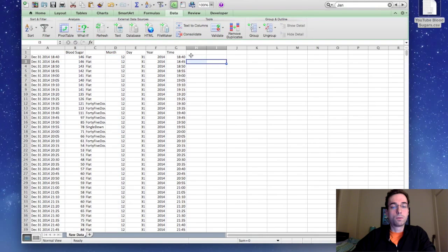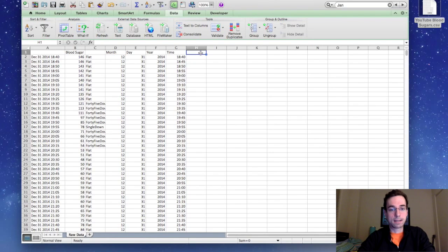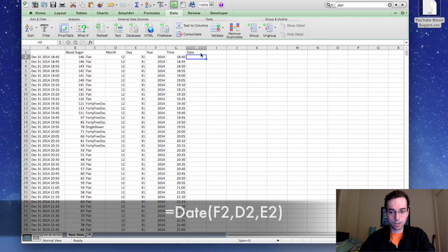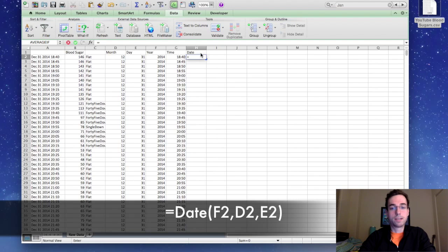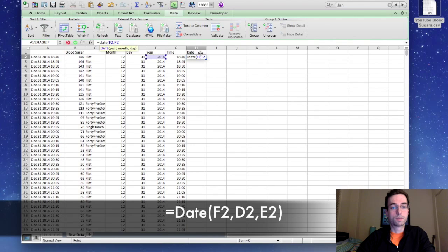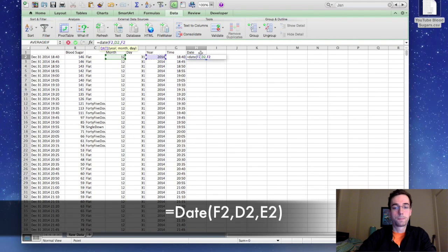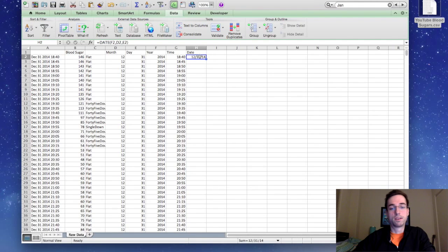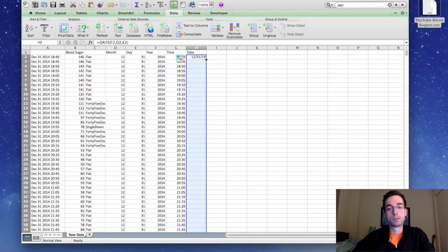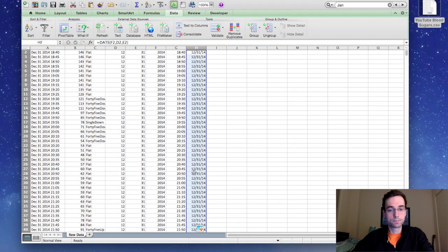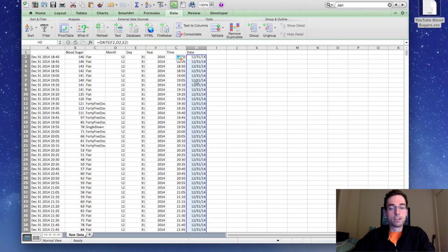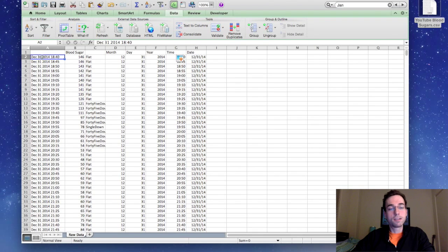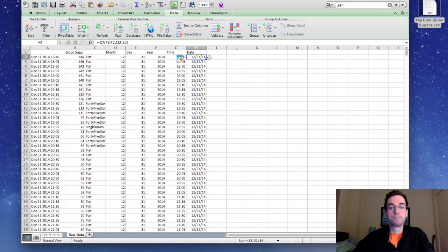And then I'm going to add a column, and this is going to say date, and you're going to say equals date, parentheses year, and you're going to highlight the column, the cell for that. So year, month, and day. So if you're following along with me, it is F2D2E2, and that should come up with that date, and then you'll double-click to drag that value down. Okay, and all that's doing is it's basically, instead of having the date written as a text file in Excel, it recognizes it now as a date.